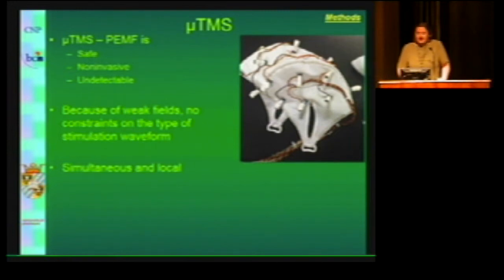The stimulation technique we are using is micro-TMS, also, as I said, called PEMF. You can see here small magnets. These are electromagnets which can produce any kind of waveform, and they can produce a magnetic field flux of 0.3 millitesla.